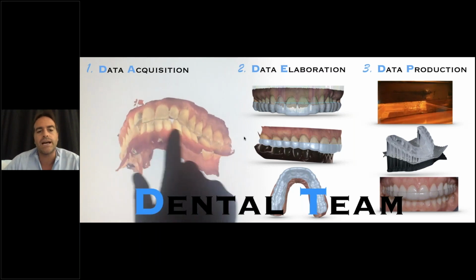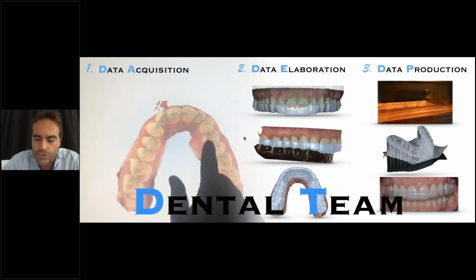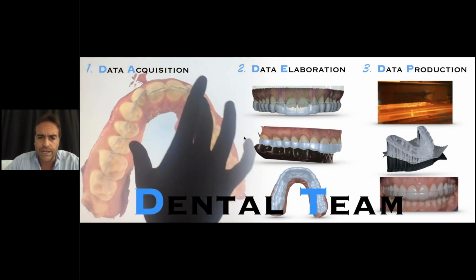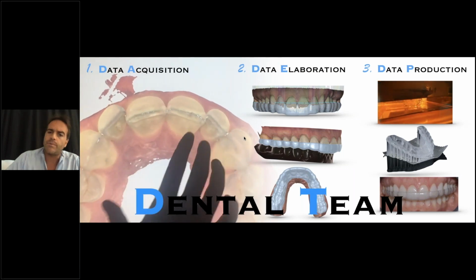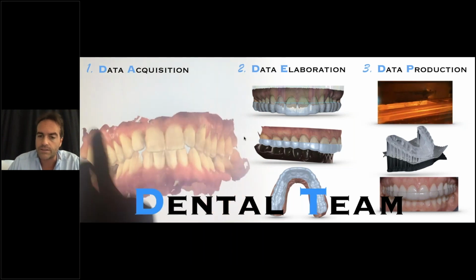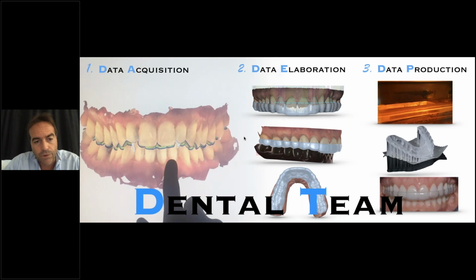And already by utilizing the intraoral scanning, besides the comfort of the patient, which is of course a great advantage during the impression taking, but look here, we are taking a night guard. So it's something that we do, that everybody of us is doing on a daily routine in our offices.